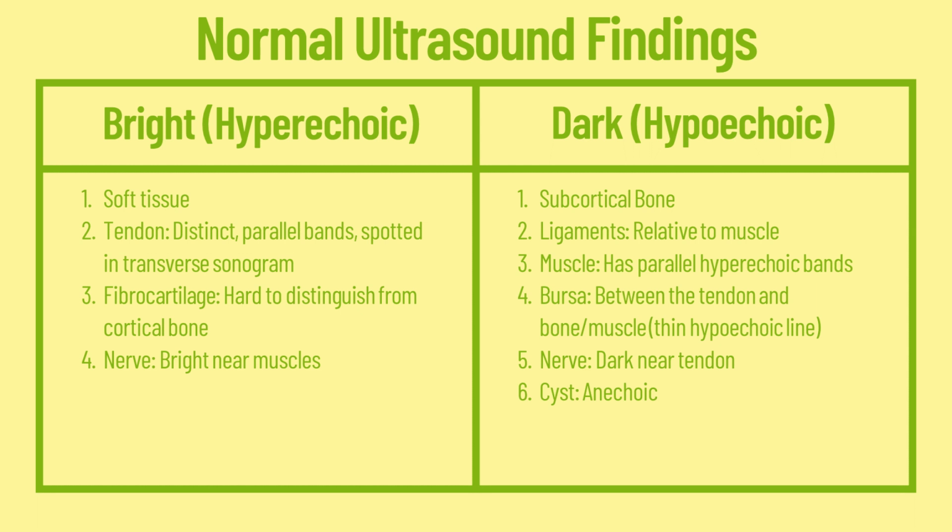Also, location, know your anatomy. If you are doing the ultrasound yourself, you are going to be able to palpate and feel what you should be going over. So the minute you put that ultrasound transducer on the skin, you should have a great idea of what you're looking at already based on your foundational anatomic knowledge, which is amazing.